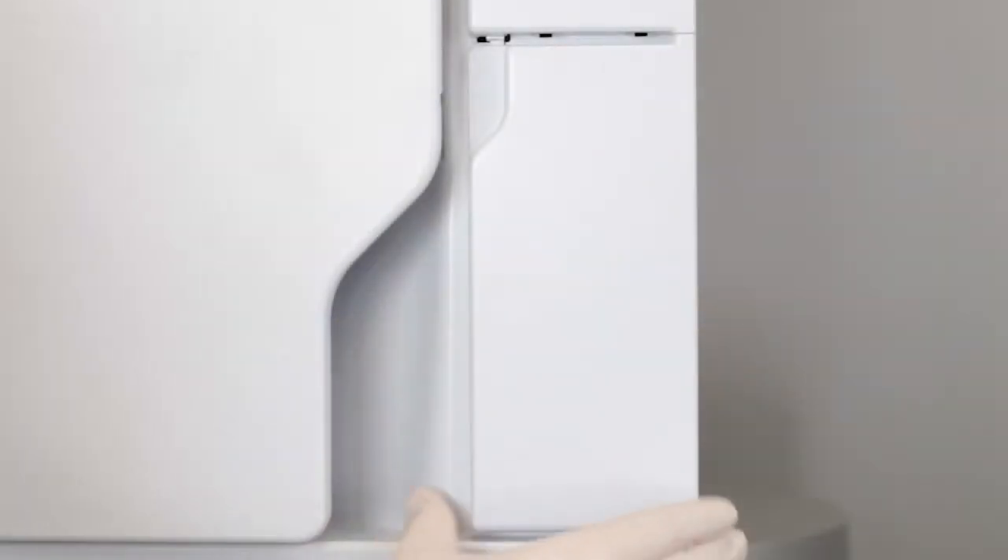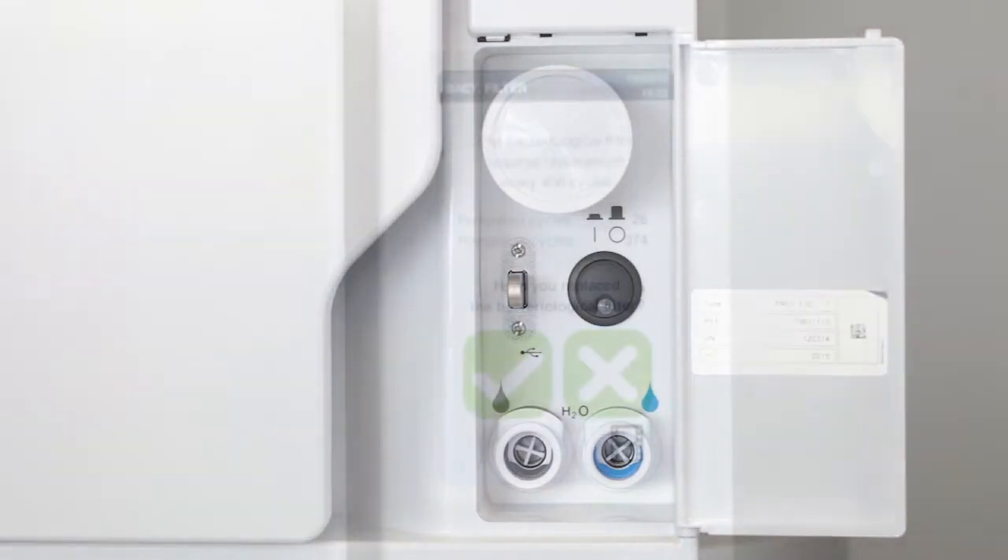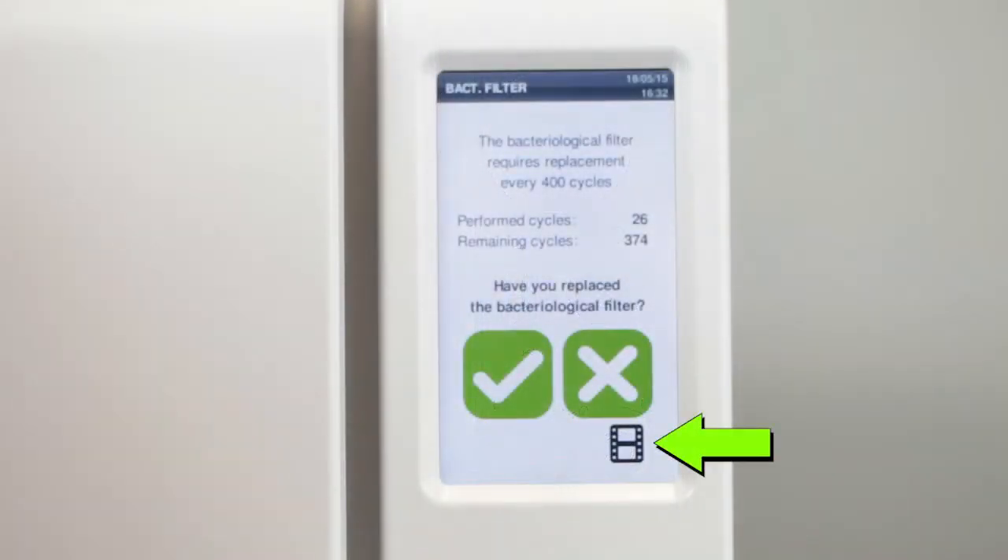The filter is located behind the maintenance door. Select the icon on the display to begin the animation showing how to replace the bacteriological filter.